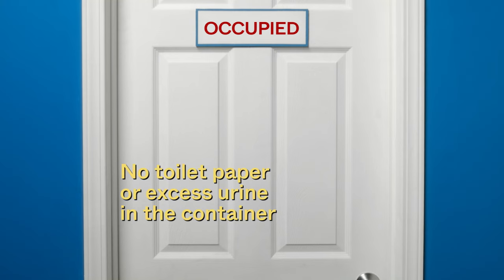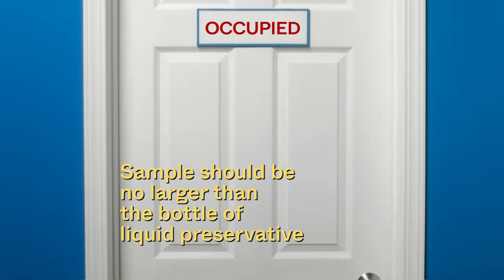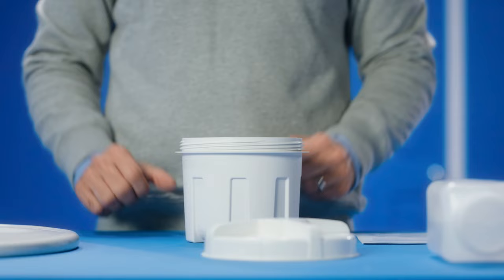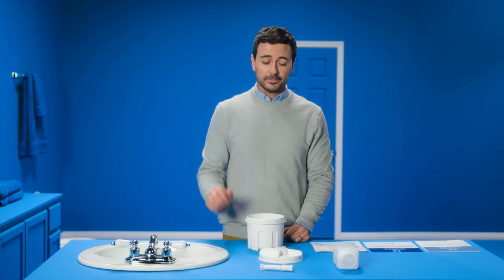Step 3: Now it's time to do your thing. Sit on the toilet and have a bowel movement into the container. Be careful not to contaminate your sample — it's OK if a little bit of urine gets in. Your sample should be whatever is typical for you in terms of consistency and size, but should be no larger than the bottle of liquid preservative that comes with your kit. When you're done, stand up, lift the container from the bracket, and place it on the counter. Leave the sample container open because there are still a few more steps before you're ready to ship.